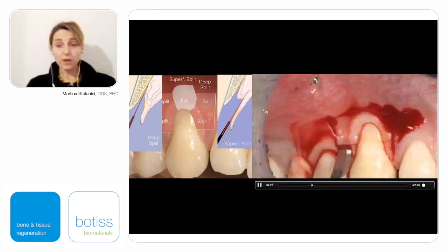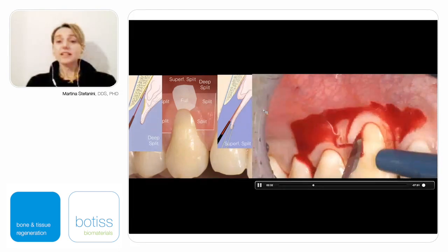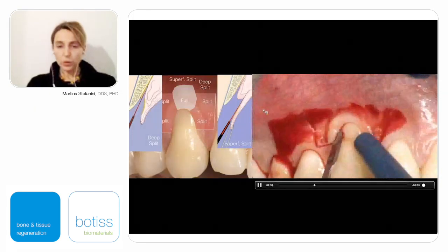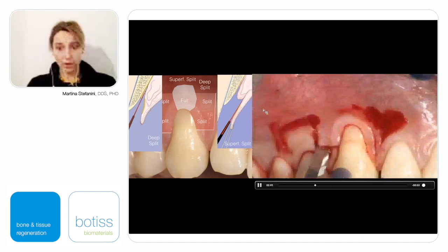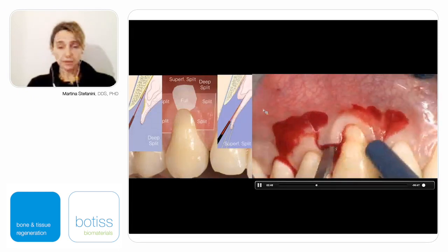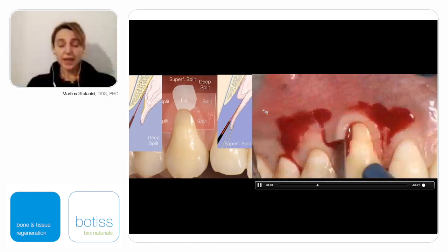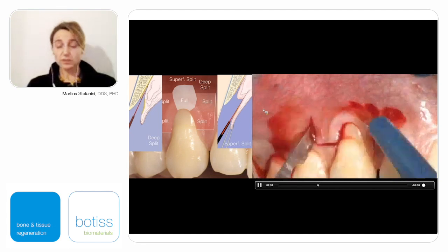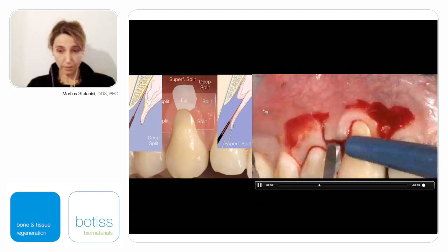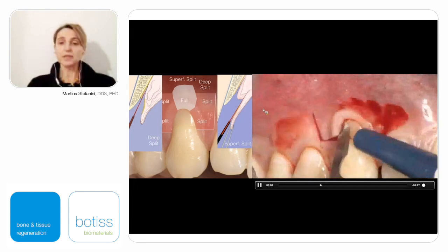These papillae are wide, are big, are very easy to handle, and since they are elevated split thickness, once we place them above the anatomic de-epithelialized papillae, they will immediately have an anastomosis and they will remain stable in the final coronal position thanks to the exchange in the vascular supply between the connective tissue of the inner aspect of the split thickness papilla and the connective tissue of the anatomic de-epithelialized papilla.